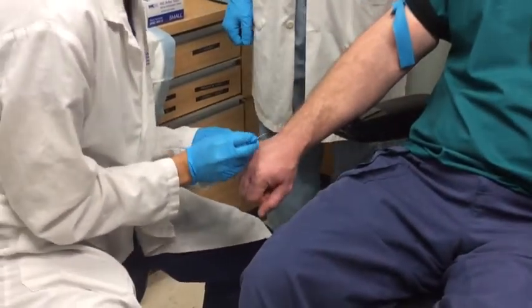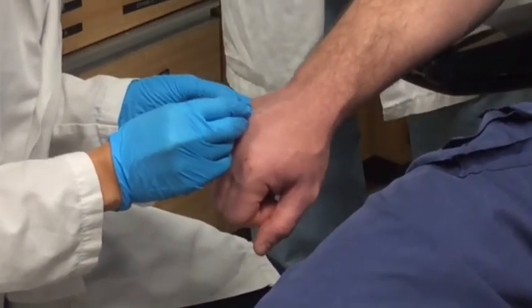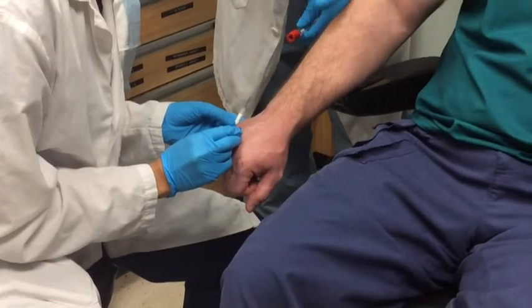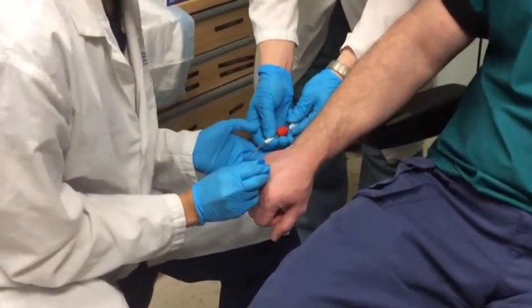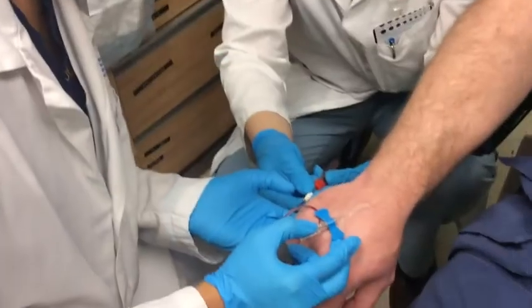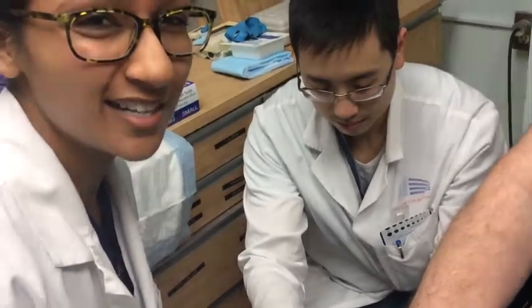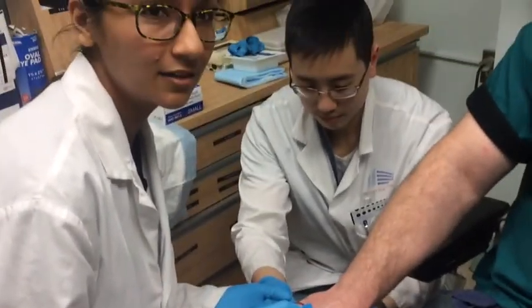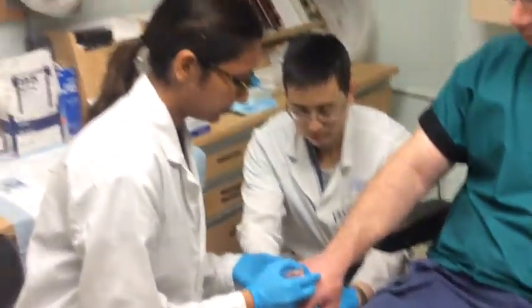You're going to feel a little prick, sorry. And we're good. Here we release the tourniquet — it's actually better to keep the tourniquet in place until you're done collecting your blood specimen. While we fill these tubes of blood, we'll just take two. Keep in mind that you also want to do serology on your patients. The recommended serology includes hepatitis C virus, hepatitis B, HIV, and syphilis — those are the recommended four serologies to get beforehand.